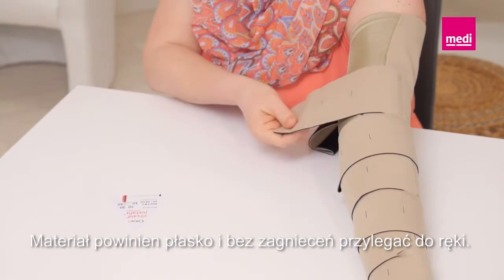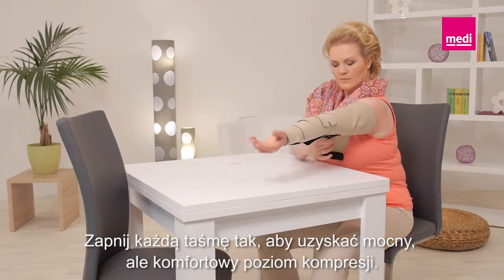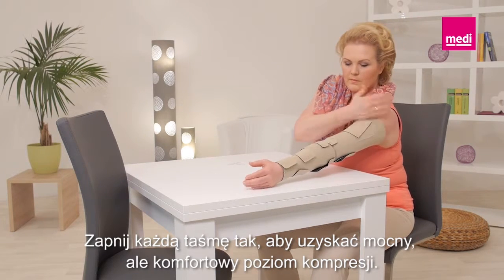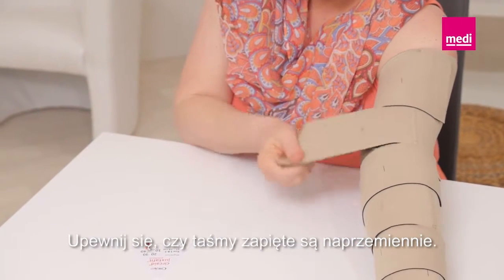The garment should lay flat and wrinkle-free against the arm. Adjust each band to a firm and comfortable compression level. Ensure that the bands are placed in an alternating order.